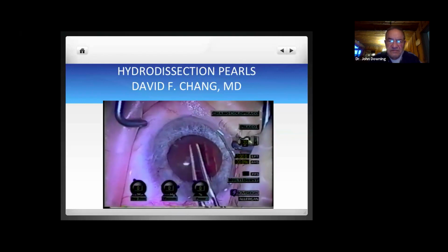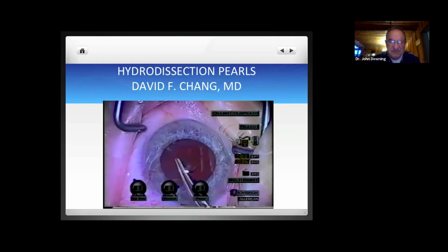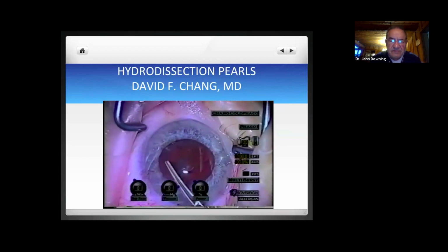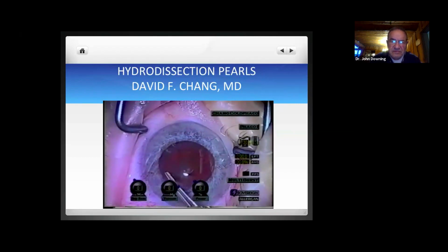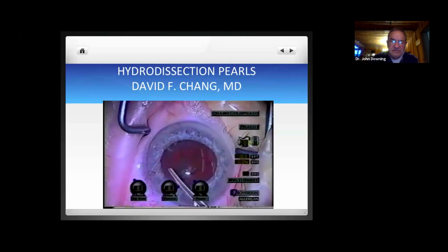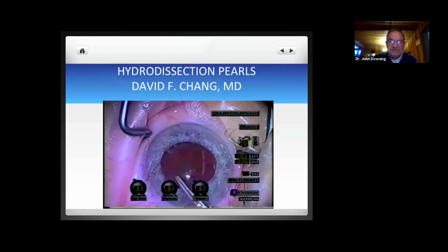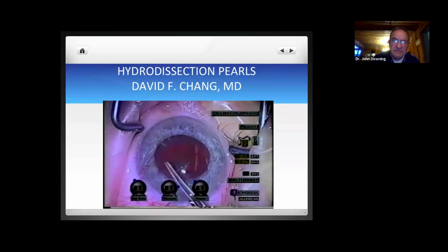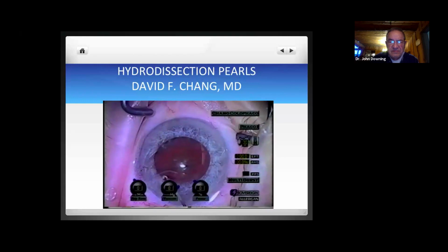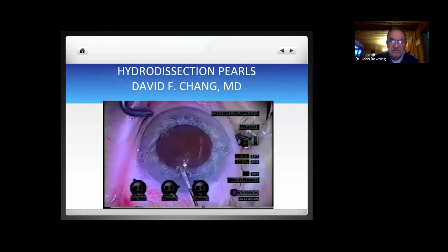This is a patient with exfoliation and a mature brown lens. And you can see that as we tear the capsular flap, the entire capsular bag is moving, indicating that we have very loose zonules. This is often the first indication when you're doing the capsulorhexis, and you see the wobbly lens, you see the entire lens move with traction on the capsule, and you know you're dealing with very loose zonules, as we would expect in this very elderly patient with exfoliation, and again, a 4+ brunescent lens.